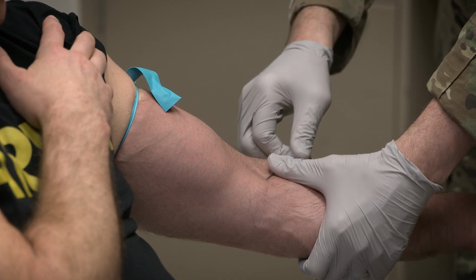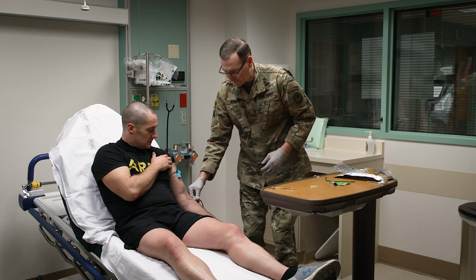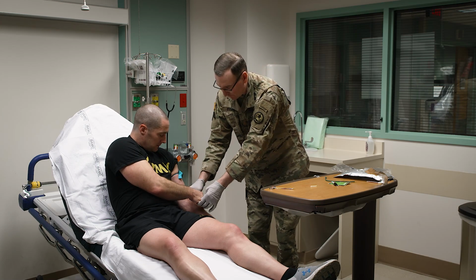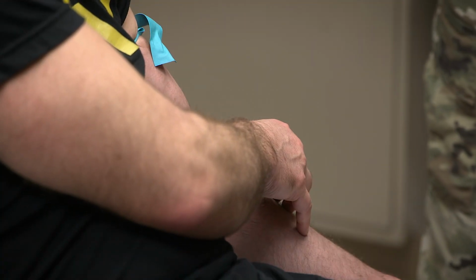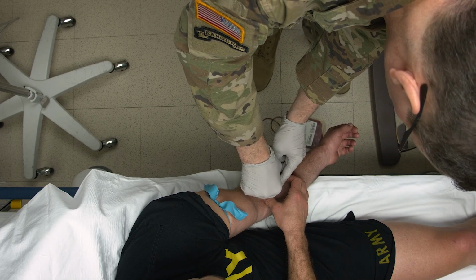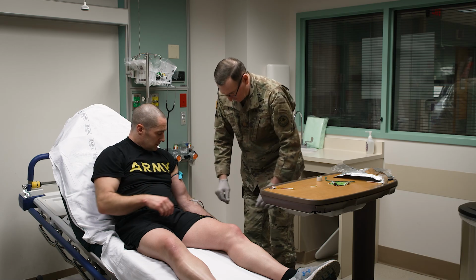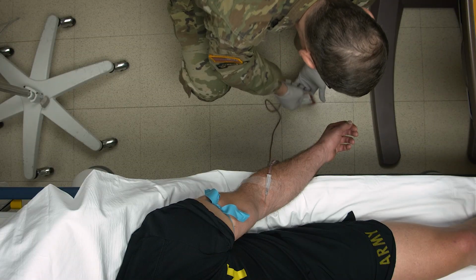You can see that the blood is flowing into the bag. At this point, I can go ahead and leave the constricting band on. I'm going to have my patient, my donor, help me by holding the needle in place while I go ahead and tape it down. You don't need a lot of tape here. This is mostly just to keep it in place while the blood collects. And I can see down here that my blood is starting to fill the bag.